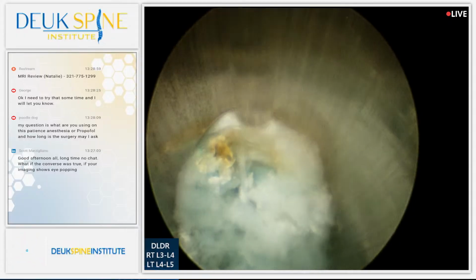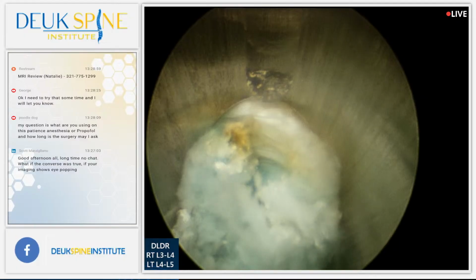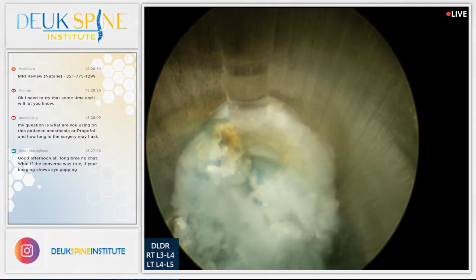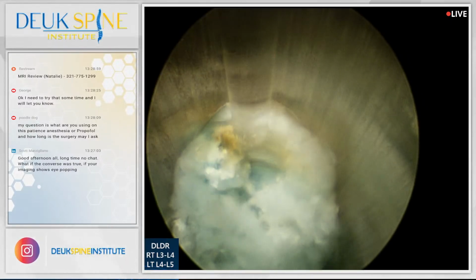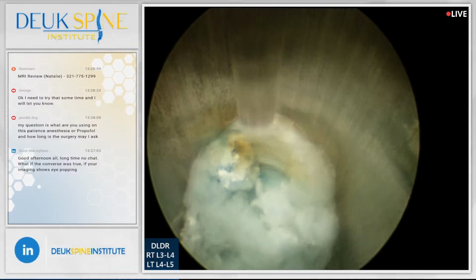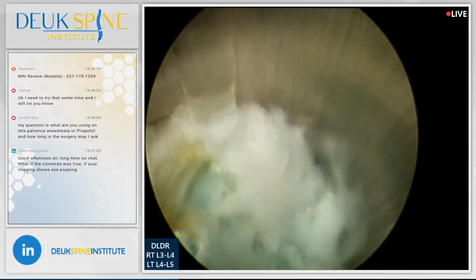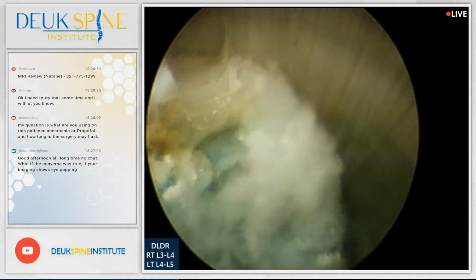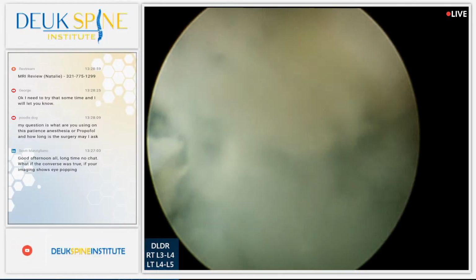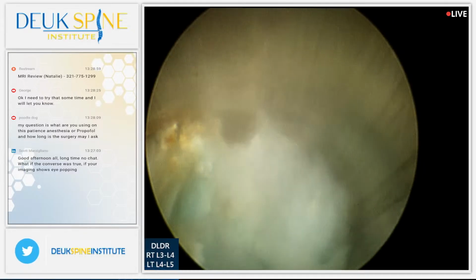By the way, I want to point something out while we're here, okay? You guys see that little edge of the tube right there? Yes, we do. Hey, that's the end of the tube. We are inside the annular tear, right inside the herniation and tear. I want to make a point. I stuck the grabber down here and I grabbed all the pieces of herniation I could, but I could not get these out. You guys see that? They're stuck down, scarred down. That's why you must have a laser. Laser is absolutely necessary to do the surgery. You cannot do it with the grabbers.